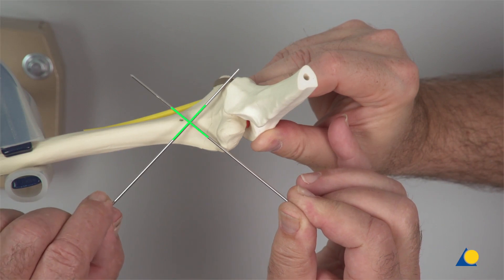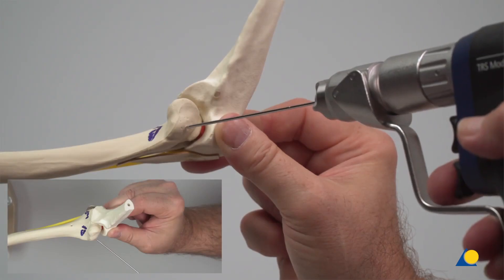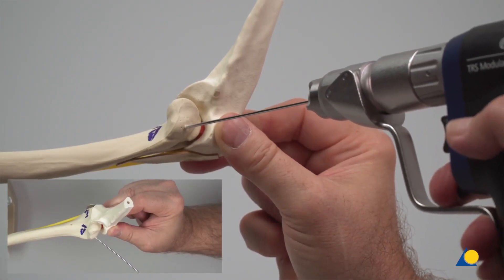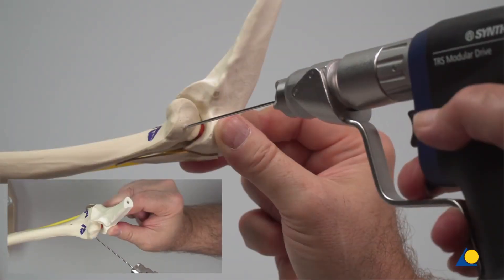Additionally, optimum fixation is achieved by planning K-wire insertion through both the lateral and medial columns of the olecranon fossa. Observe that the K-wire must not be inserted through the center of the capitulum as this will result in placement outside of the humeral axis. In order to achieve satisfactory fixation from the radial side, the K-wire is inserted in the direction of the shaft axis.